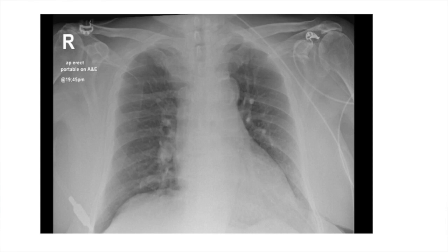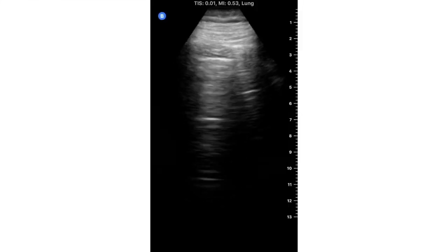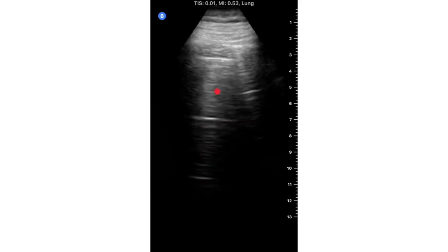Patient is referred to us, asymptomatic, normal chest x-ray, but referred as suspected COVID. Remember, everybody is COVID consumed. We've been brainwashed by COVID, so everyone coming through the front door has got COVID. But we need to think laterally. So this is a chappie with a normal chest x-ray, and I did a scan, and you can see it's a normal scan. You've got nice bright pleura, sliding, and got A lines throughout, and that scan was normal throughout, and that reassured me the patient could go home.